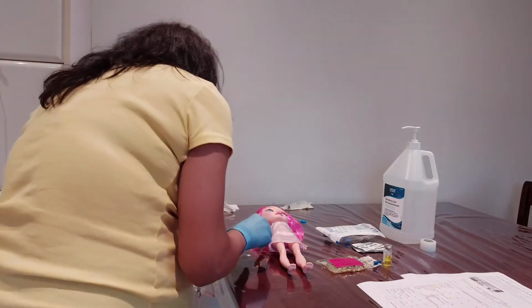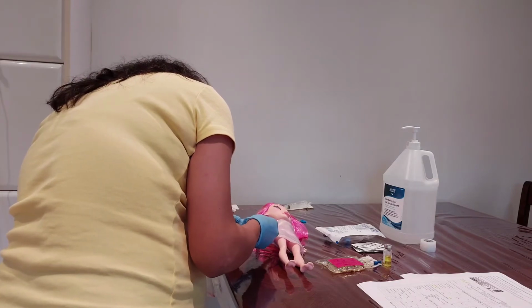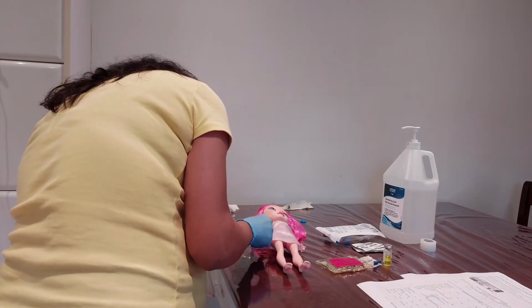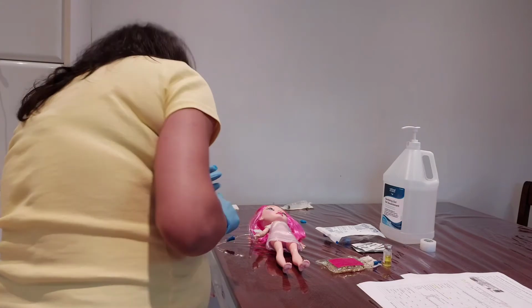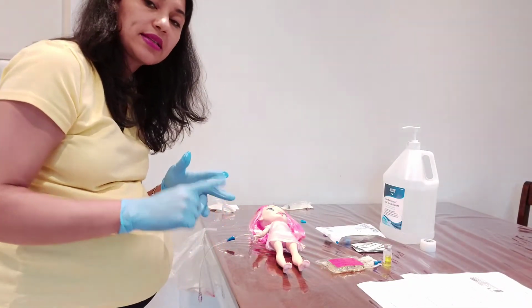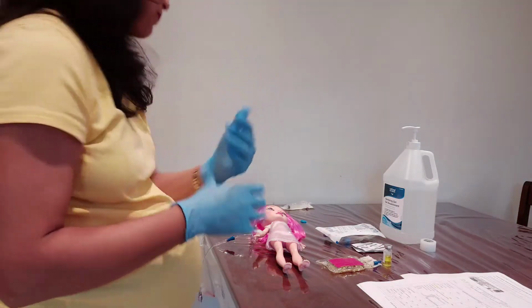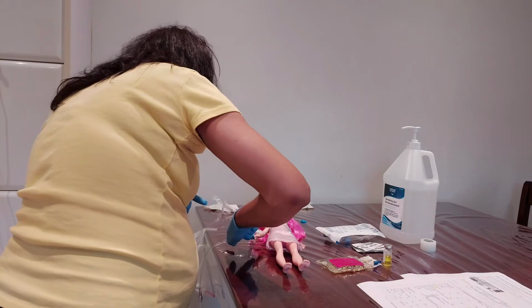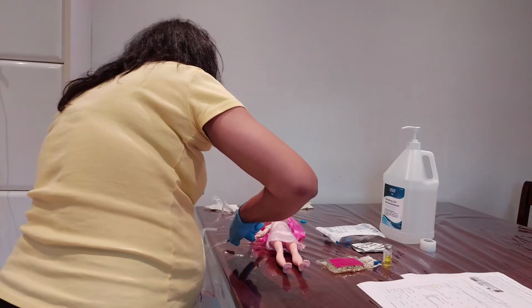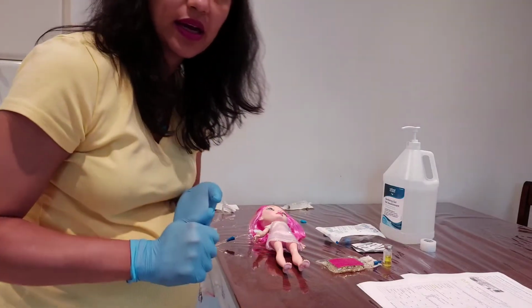Let's start. First, I will check your hand, the site. Okay, no redness. I will check for pain, redness and infiltration. Is there any pain? Any tenderness here? No? Okay, perfect. Thank you. So I can continue my job.